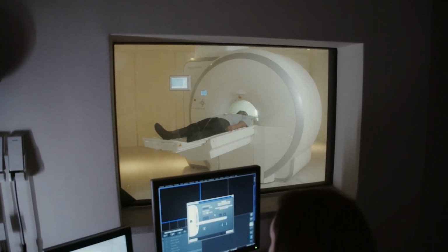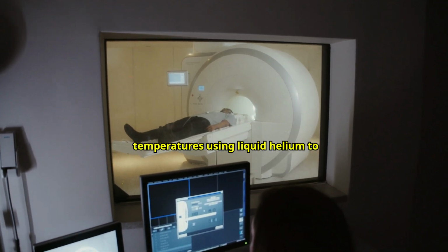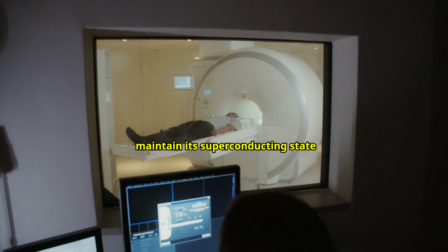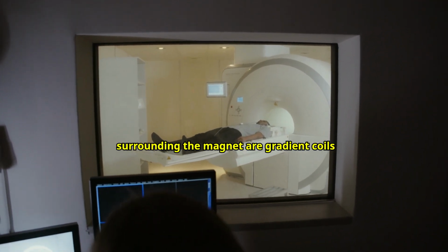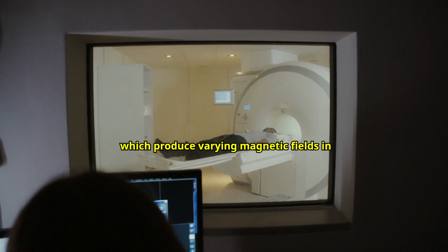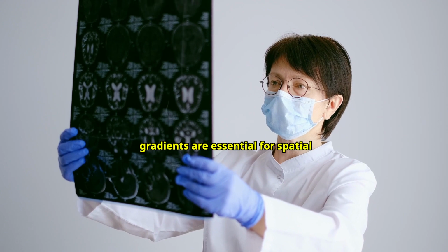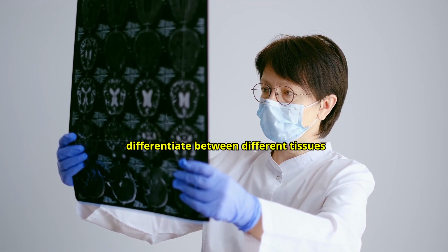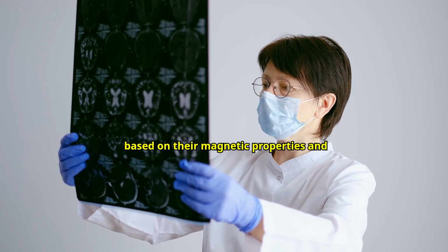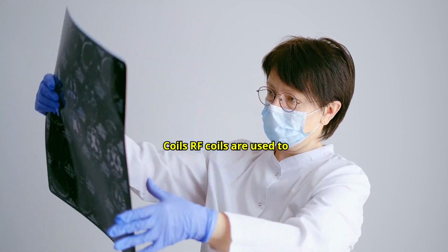research-grade machines. The magnet is usually cooled to cryogenic temperatures using liquid helium to maintain its superconducting state. 2. Gradient coils. Surrounding the magnet are gradient coils, which produce varying magnetic fields in different spatial directions. These gradients are essential for spatial encoding, allowing the MRI machine to differentiate between different tissues based on their magnetic properties and location. 3. Radio frequency coils.